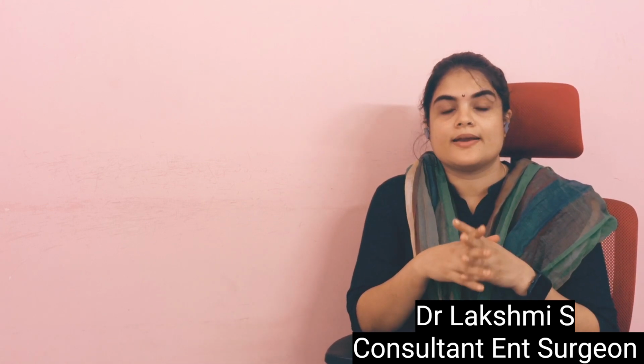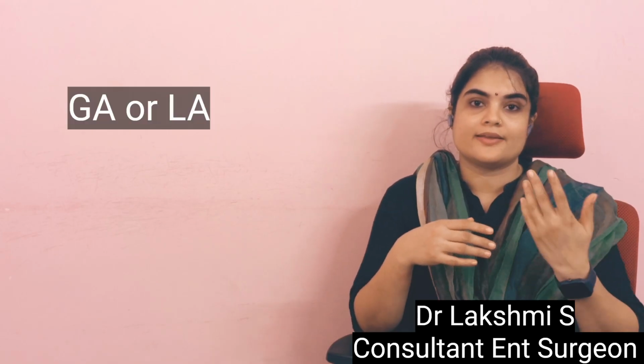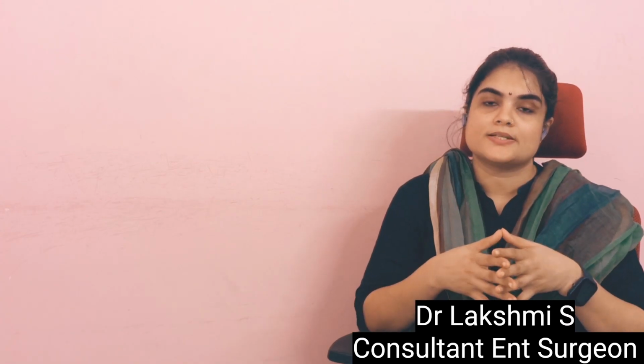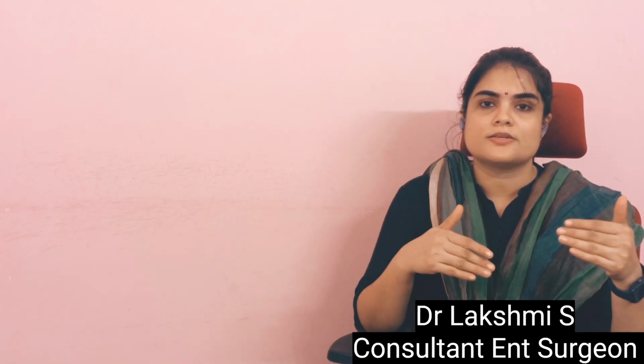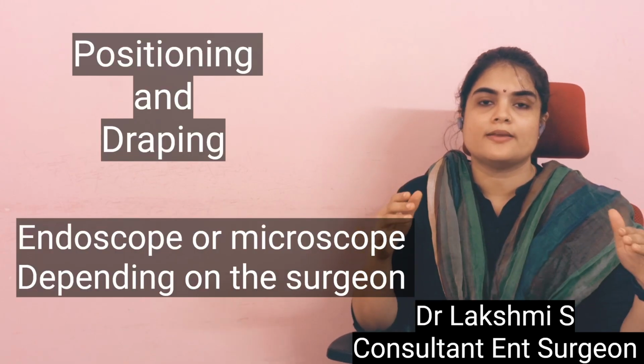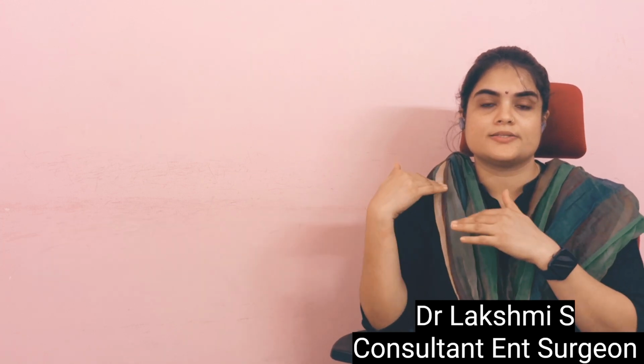The surgery can be done under general anesthesia or local anesthesia. Certain surgeons prefer local anesthesia because the patient can immediately communicate on the table that the hearing has become better, and also if any complication like vertigo has occurred, the patient can complain on the table of vertigo or giddiness. Some surgeons prefer general anesthesia because of more cooperation from the patient, less movement during the procedure and all that. The usual positioning for ear surgery is supine with the head turned to the opposite side and the shoulder tilted a little, like 10 to 15 degrees.